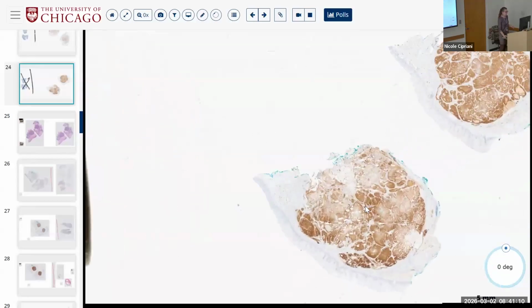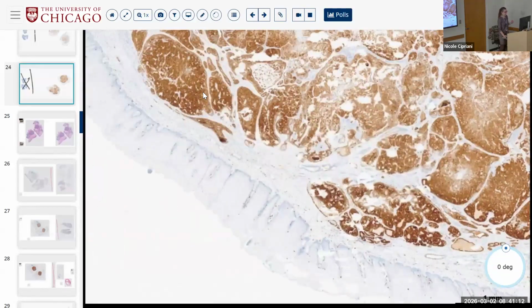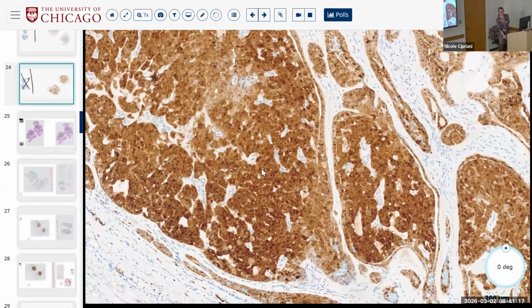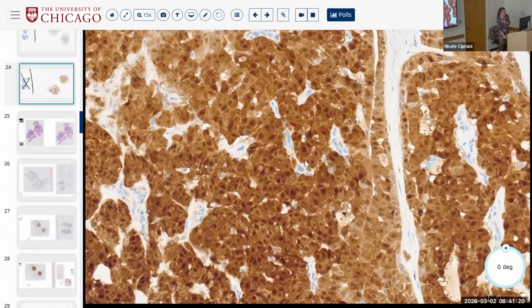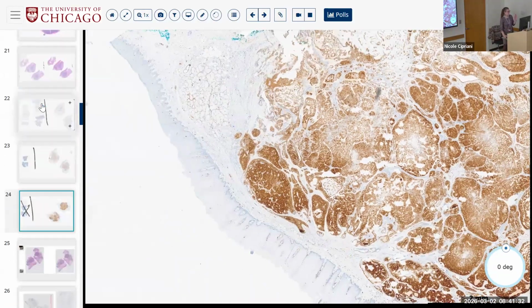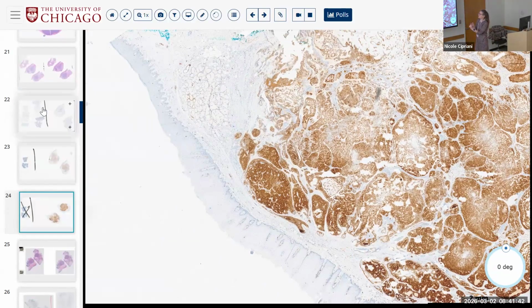However, as a P40 generally non-expressor, it is an expressor of, what would this stain be in your example? S100, right? So this is S100, diffusely staining nucleus and cytoplasm of tumor. Okay, so that would be the phenotype, morphology, and immunohistochemically, of essentially a likely monophasic tumor. I don't know what those random 5 P40 positive cells are doing. Diffusely S100 positive, polymorphous.